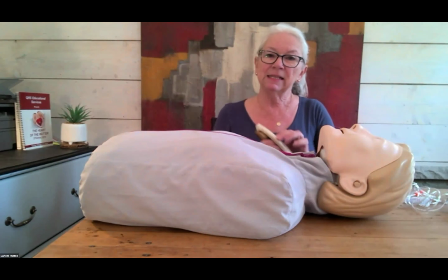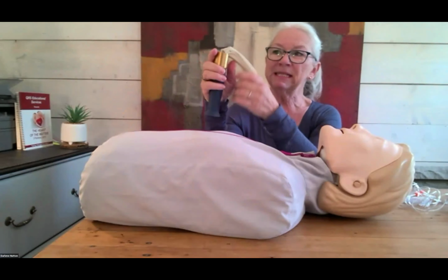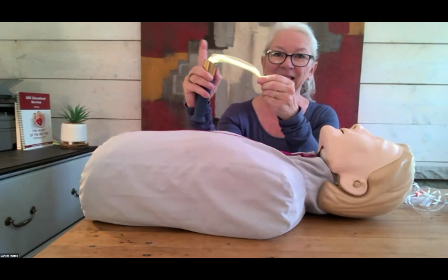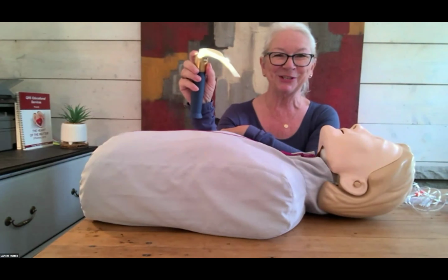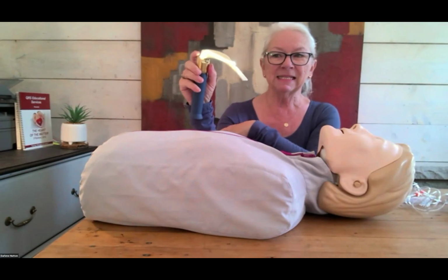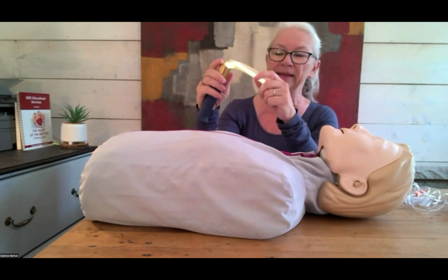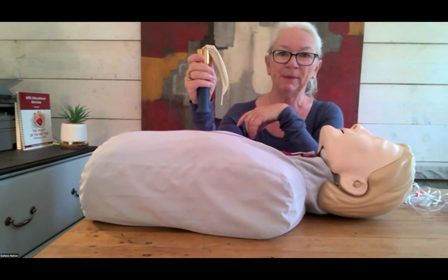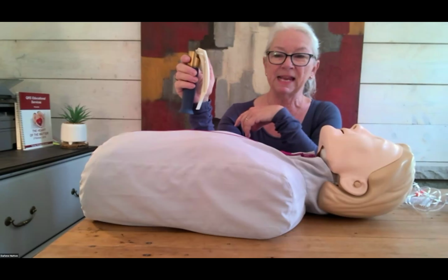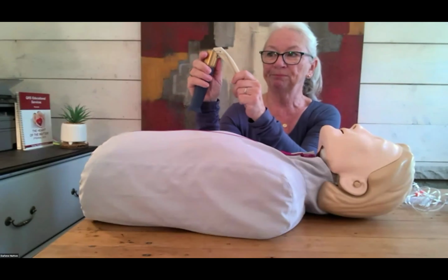Let's take a look at the 2 L's. The first is the laryngoscope. Make sure you're comfortable taking the blade off and putting the blade on. It doesn't look like it's that difficult a task until you go to do it. You may be asked to change the blade size. So rummage around and see the different blade options. They're usually located on the side here. They'll say what type of blade they are. The secret to taking the blade off is the blade needs to be kind of floppy, and the thumb of the hand holding the handle is what is going to push the blade off.